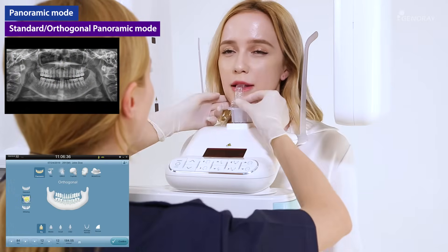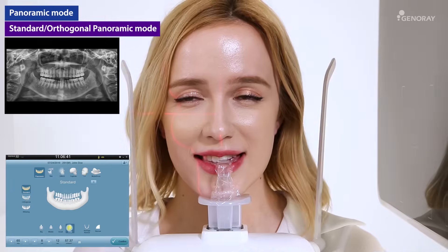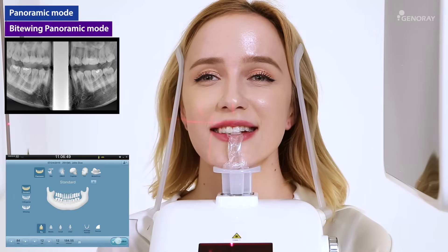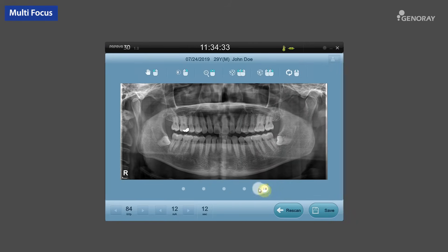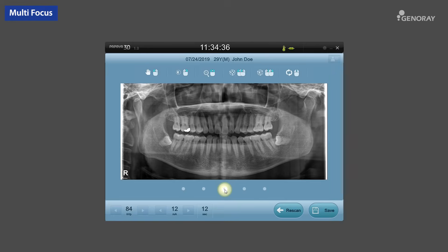Panoramic exposure mode. After selecting the desired exposure mode, follow the instructions on the next page. Once the patient is properly set, select the Ready button on the OP and follow the instructions on how to hold the hand switch down until the exposure is completed. Select the optimal image according to the multi-focus image set and save it. If rescanning is needed, click the Rescan icon.